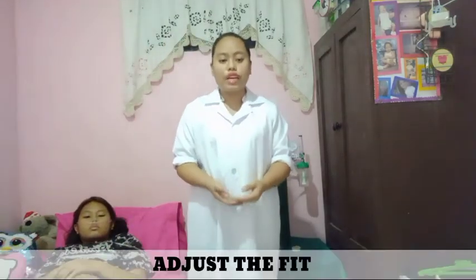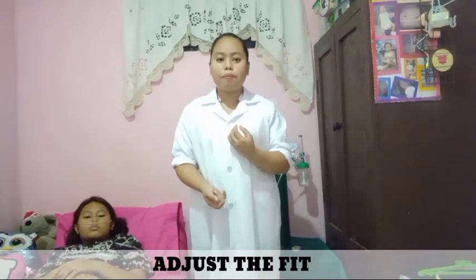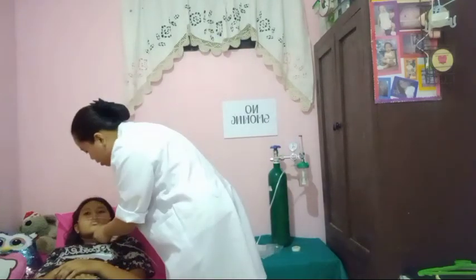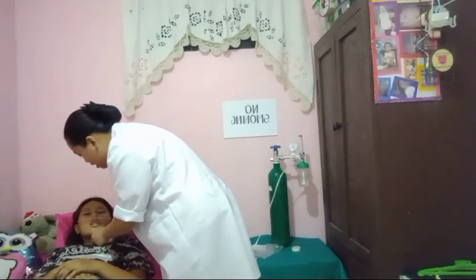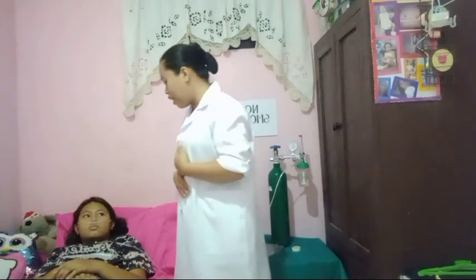Adjust the fit of the cannula as necessary. Tubing should be snug but not tight against the skin. Encourage the patient to breathe through the nose with the mouth closed.